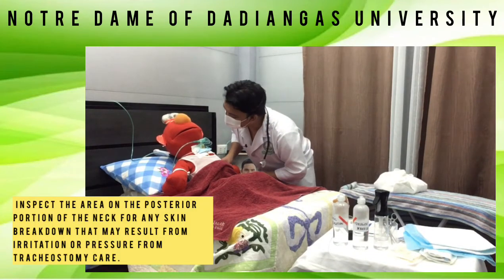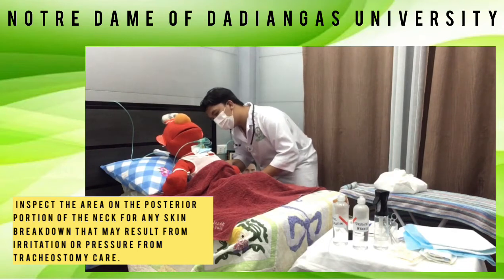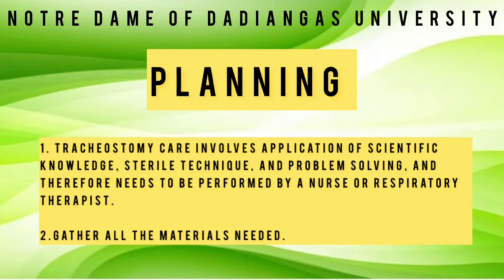Inspect the area of the posterior portion of the neck for any skin breakdown that may result from irritation or pressure from tracheostomy care. For planning, tracheostomy care involves application of scientific knowledge, sterile technique, and problem solving, and therefore needs to be performed by a nurse or respiratory therapist. Second, gather all the materials needed.